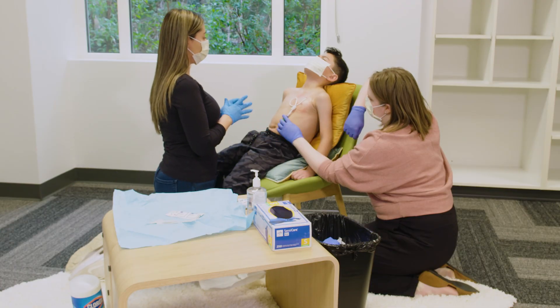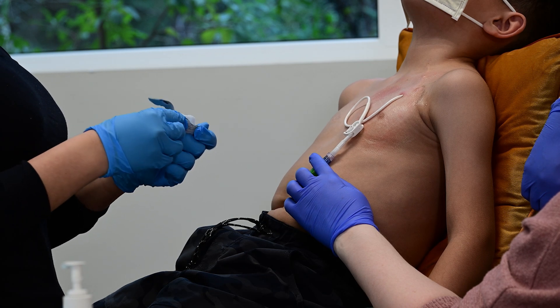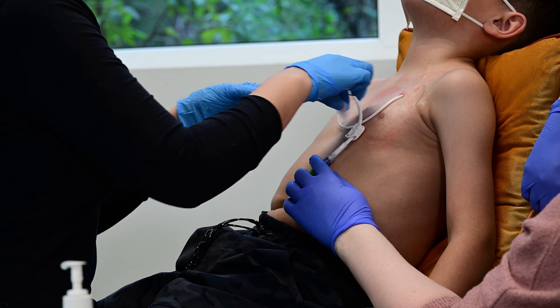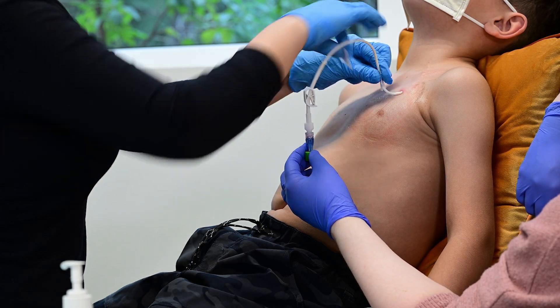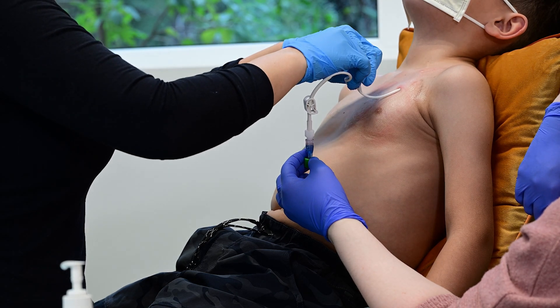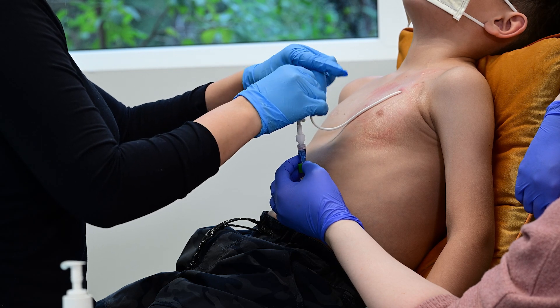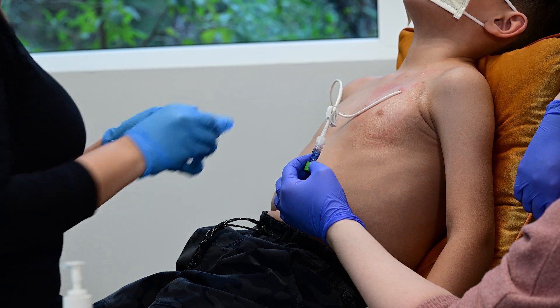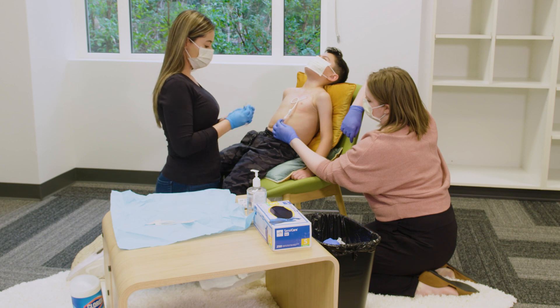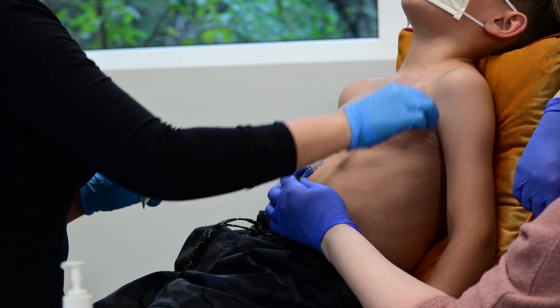While you are waiting for the skin to dry, begin to clean the central line. Start at the insertion site and clean in one direction down the line. After the skin is dry, apply the skin barrier such as Cavalon, which is a separate package in the dressing change kit. Leave about an inch window around the insertion site — this protects the skin and helps keep the dressing secure.